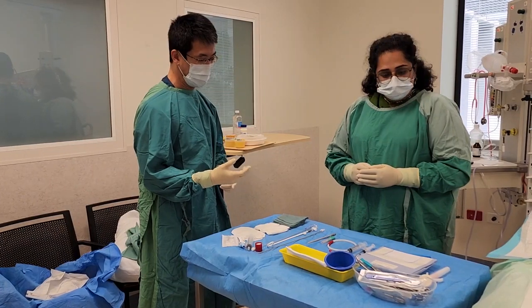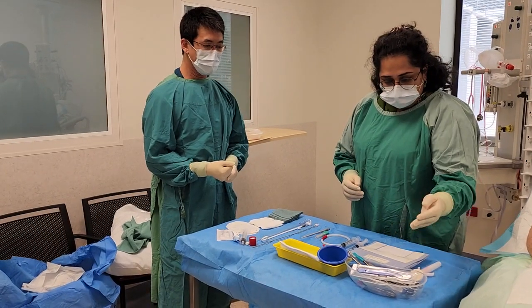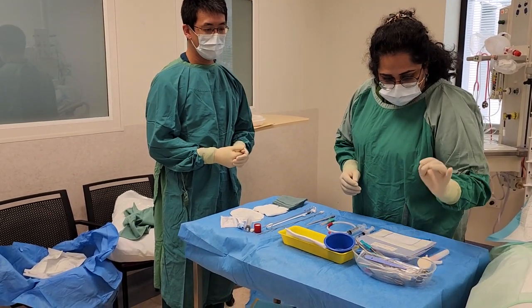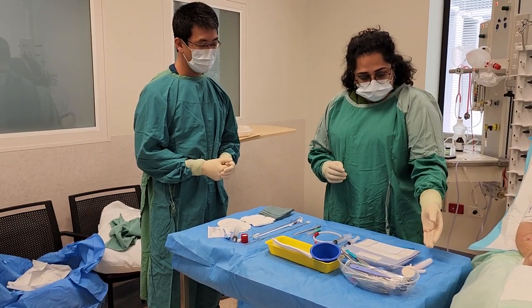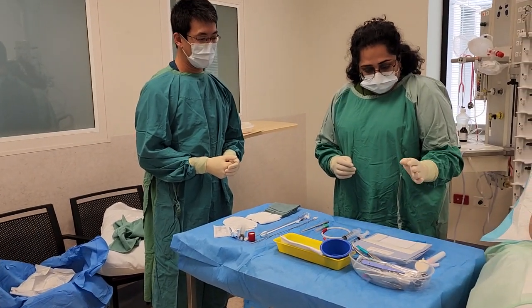Equipment-wise, what do we have here? So equipment-wise, I've put all of my sharps and suturing equipment in here, including some forceps, some scissors and suturing paraphernalia. I've got a chlorhexidine wand for cleaning the area, and I've got some drapes.